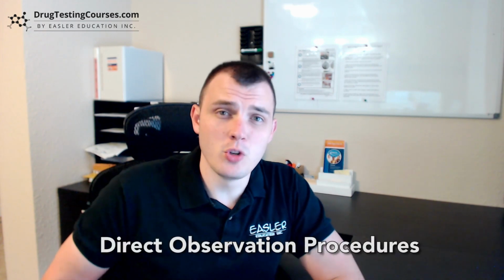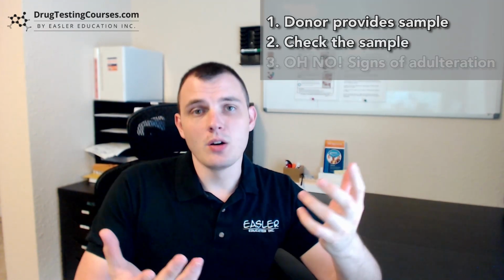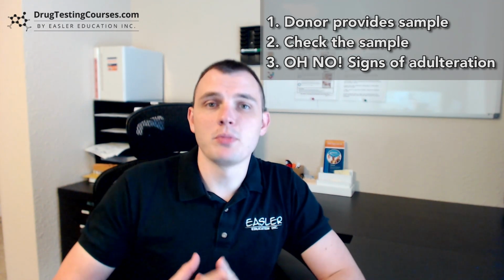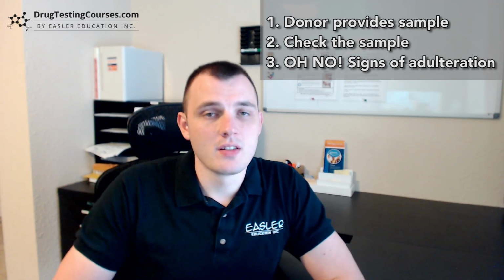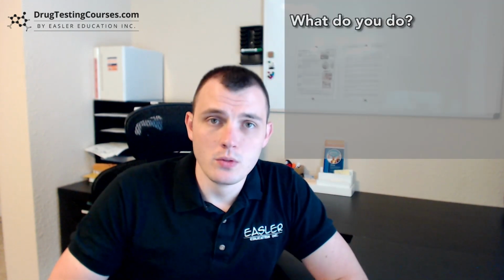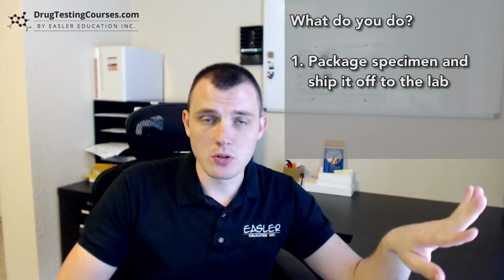Today I wanted to talk to you about direct observation procedures. So let's say you're doing a DOT urine specimen collection, the donor has provided you a sample, you've checked it out, and you see that it's got blue or green or it smells like bleach. Obviously there are signs that it has been adulterated. So what do you do? First thing we're going to do is package up that specimen and send it off to the laboratory.